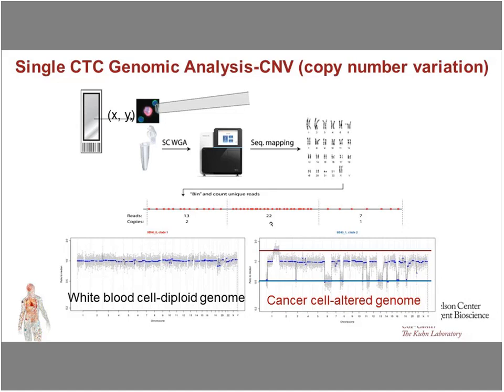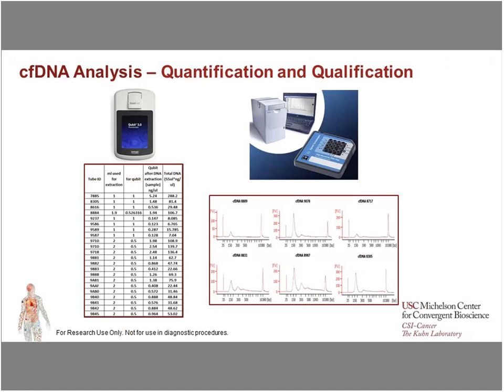For cell-free DNA, quantification with the Qubit assay and size profiling with the Bioanalyzer after extraction are must-have QC steps before any downstream analysis. The amount of cfDNA is by itself a prognostic marker, and in our workflow, we are able to investigate the relation between CTC enumerations and cfDNA amount.